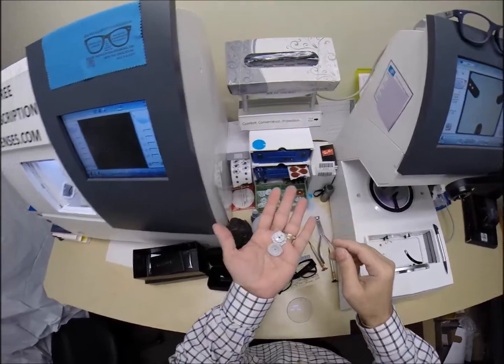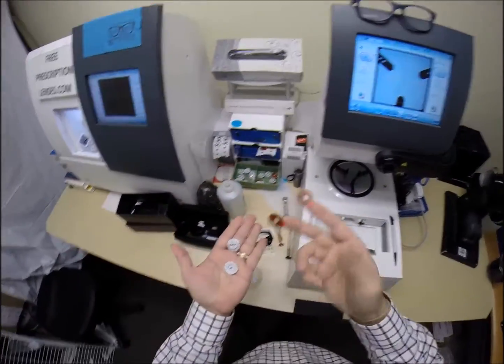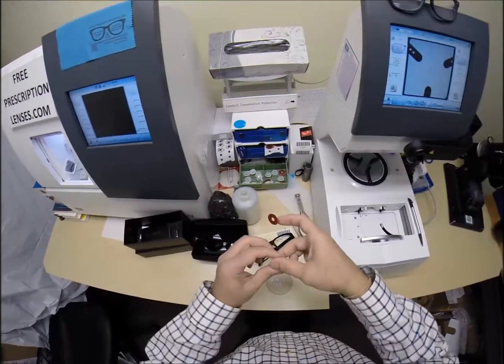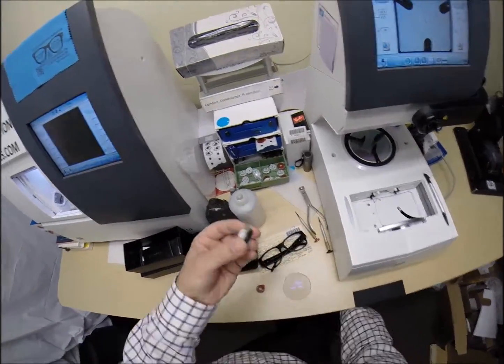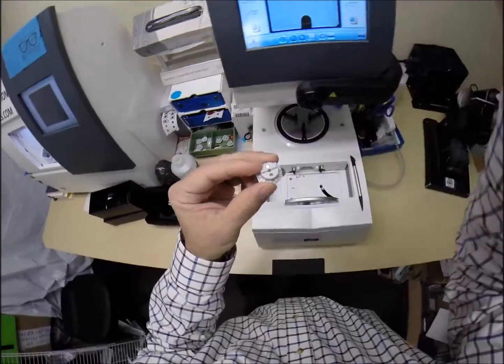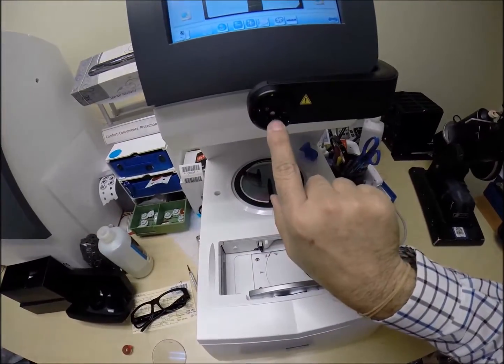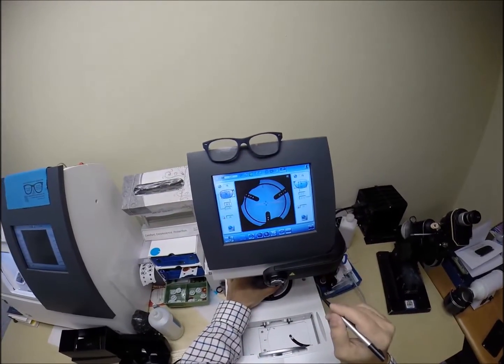I need to attach these to your lens while it is cutting, so I need two double-sided adhesive stickers. The black side is the sticky side. I'm going to stick this one onto the first block. Do the same thing now for the second one. Pull the paper away to make the black side sticky. Now on the back is a silver button. That's going to do its job twice today. The first time, that magnet is going to attach itself to another magnet there in the arm. Place that there. Make sure everything is lined up perfectly.